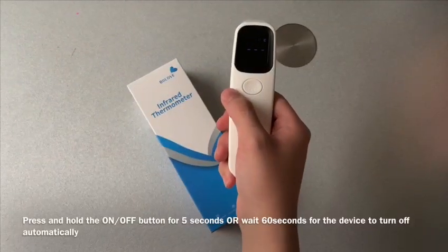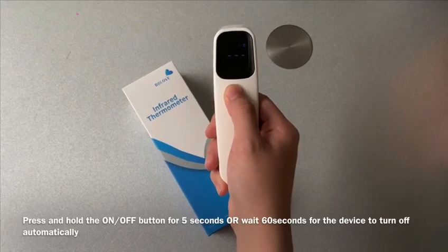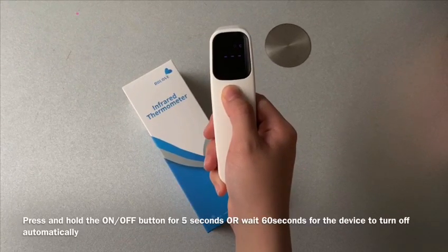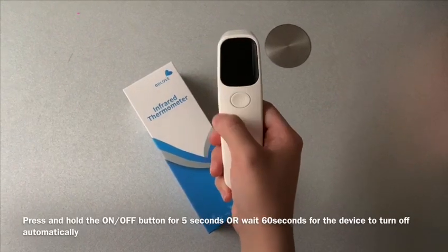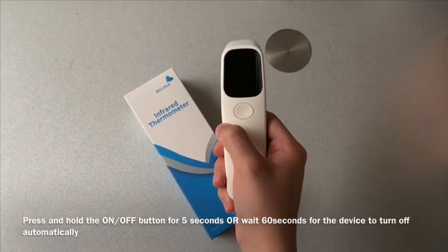To turn off the device, press and hold the on-off switch for 5 seconds. Alternatively, the device will turn off automatically after 60 seconds.